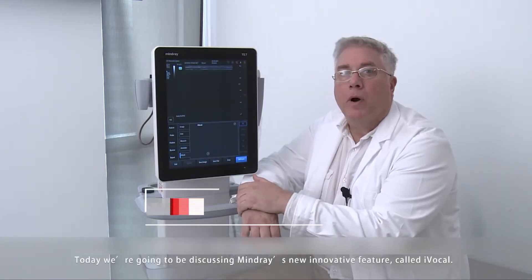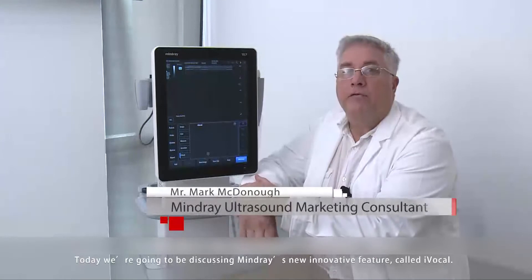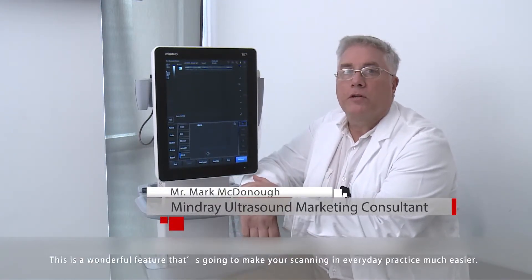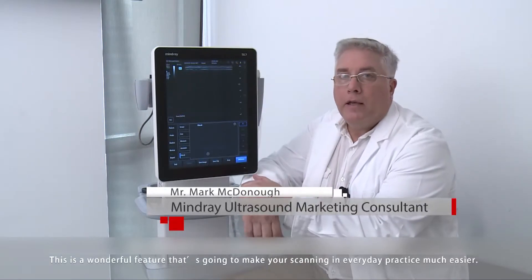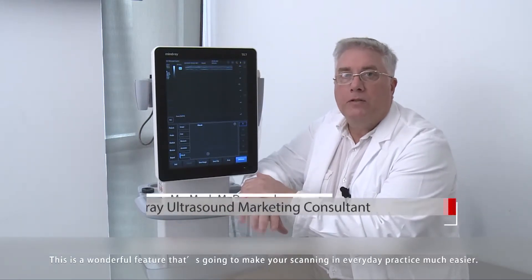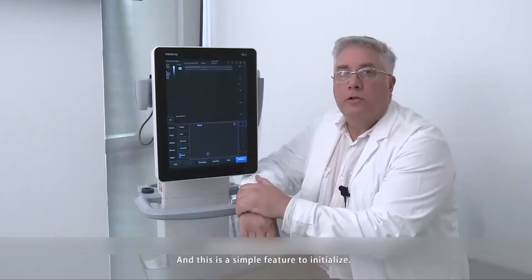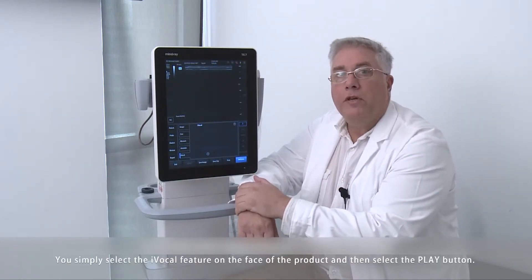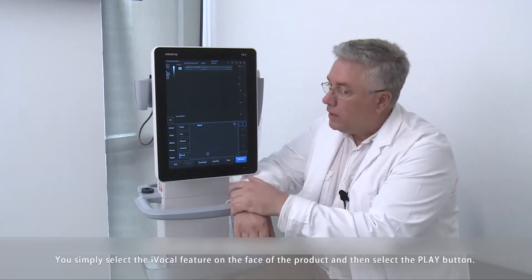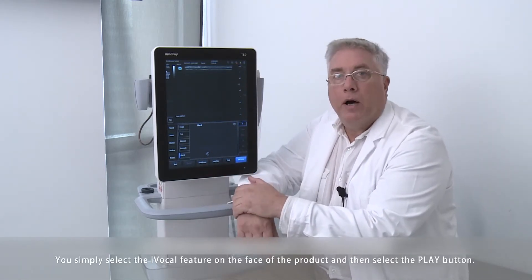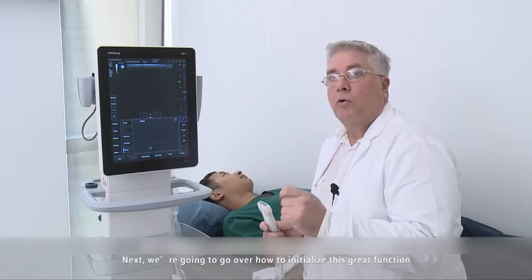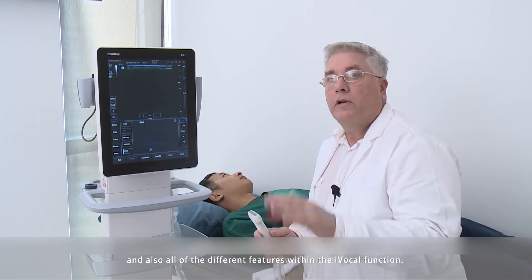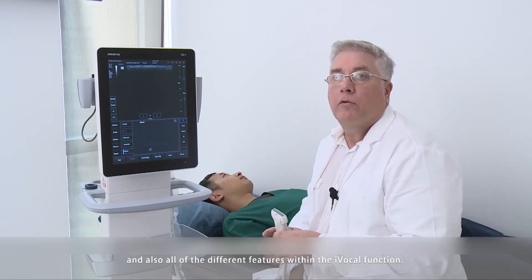Today we're going to be discussing Mindray's new innovative feature called iVocal. This is a wonderful feature which is going to make your scanning in everyday practice much easier, and this is a very simple feature to initialize. We're going to go over how to initialize this great function and all of the different features within the iVocal function.